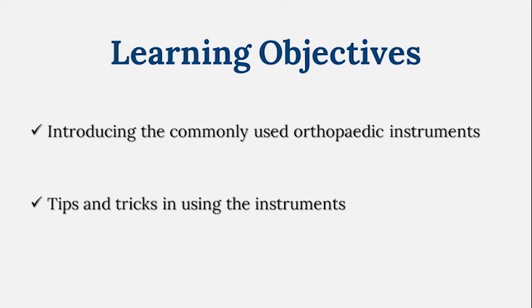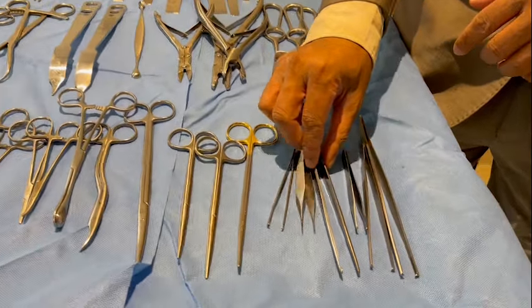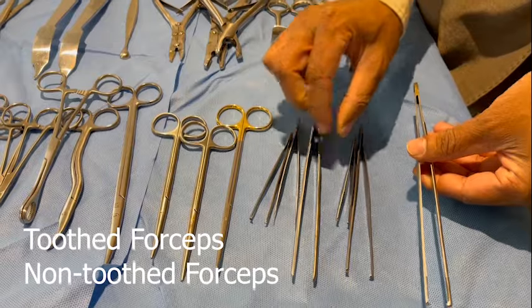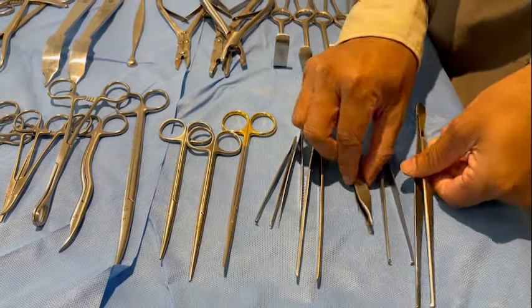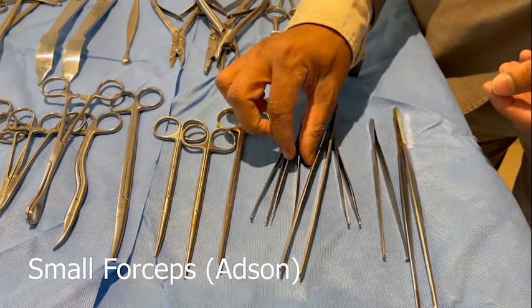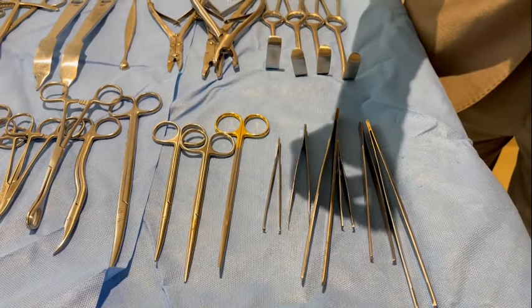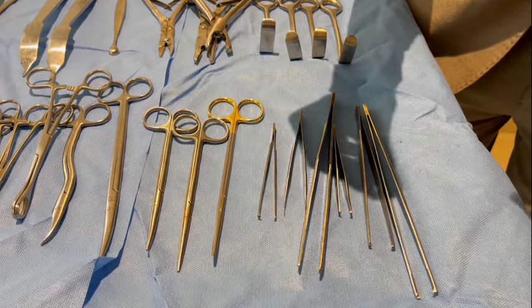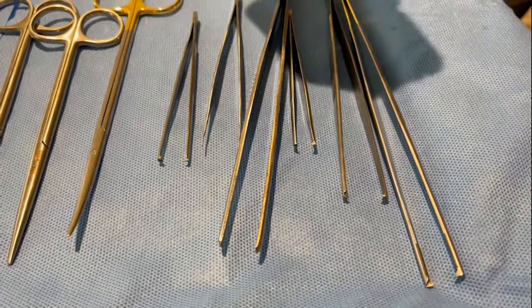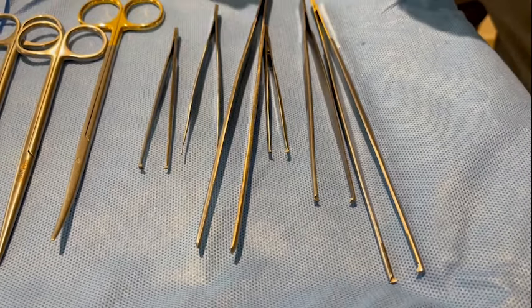Let's start with the very commonly used instruments. The most commonly used is the forceps. Here we have tooth forceps and non-tooth forceps — long and short. The small tooth forceps is otherwise called Adson's, and the small non-tooth forceps is also called Adson's forceps.